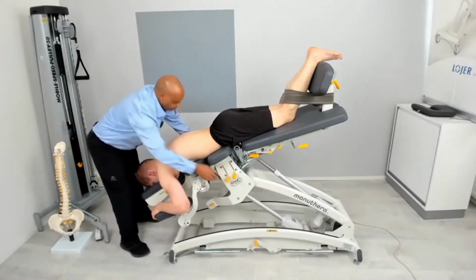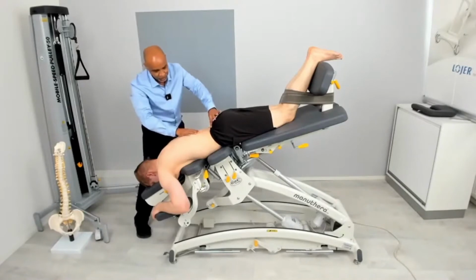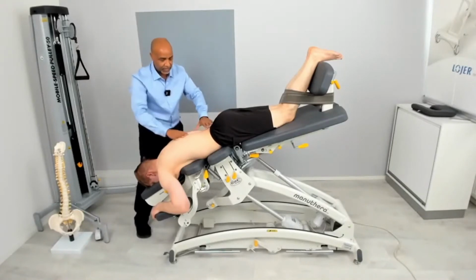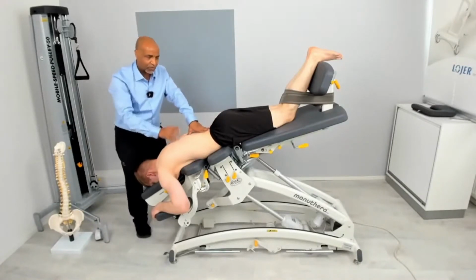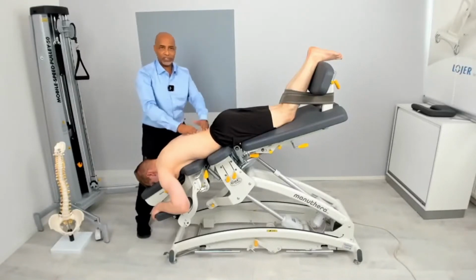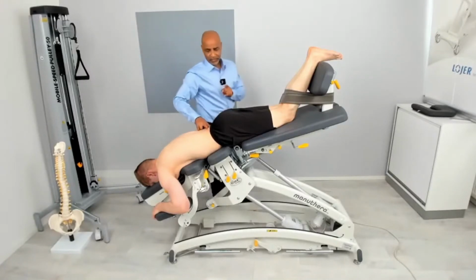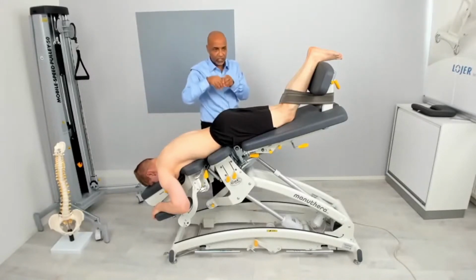So from this point now, we already know that this is a decompression of the lower back. And again, thank God for this particular treatment table, you don't need another machine to do traction. You're using all of it in one. And then from there now, remember we're talking about the ligaments and the disc, which are much deeper.